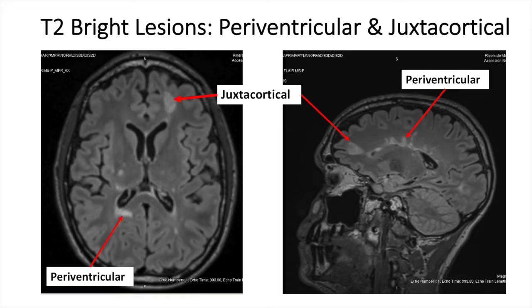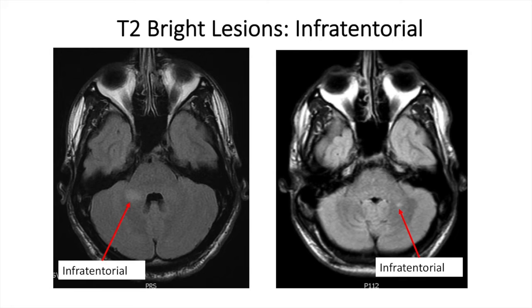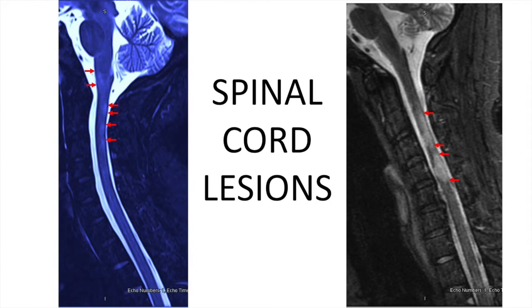The second example is juxtacortical. Juxtacortical means the lesion is located right at the junction between the gray matter on the outside of the brain and the white matter underneath. Another location for MS T2 bright lesions is infratentorial, meaning in the brainstem — here you see two examples of brainstem lesions. A fourth common location for new MS lesions is in the spinal cord, as you see here on these two MRIs.